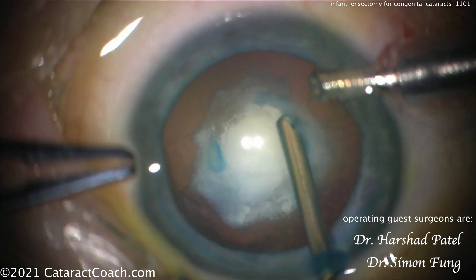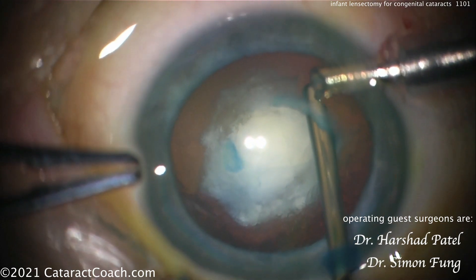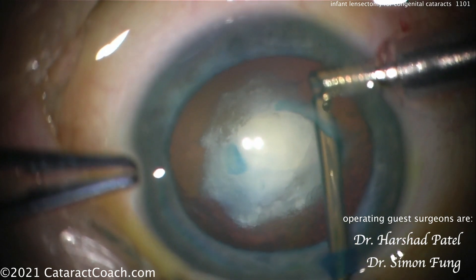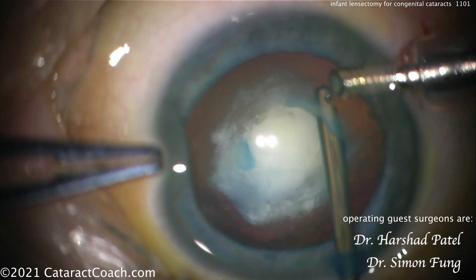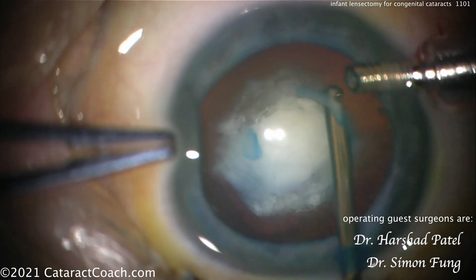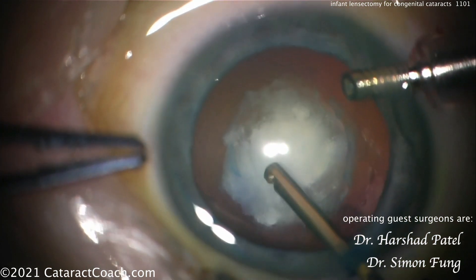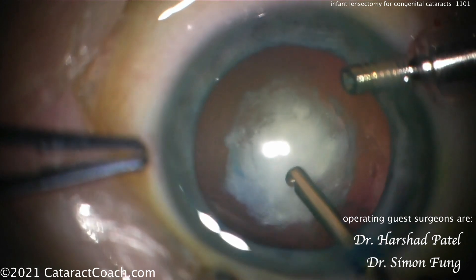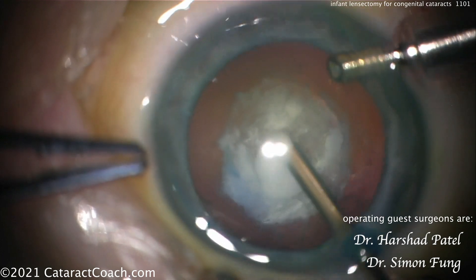Nice opening here — very conservative, just taking your time on this. We've got to do a beautiful job. These babies are so young; this baby is going to live 100 more years, and you want your surgery to pass the test of time. So, being very careful here. Now, when you're going out to the periphery to clean up any of the lens cortex or lens material, how do you avoid damaging the capsule or bag?